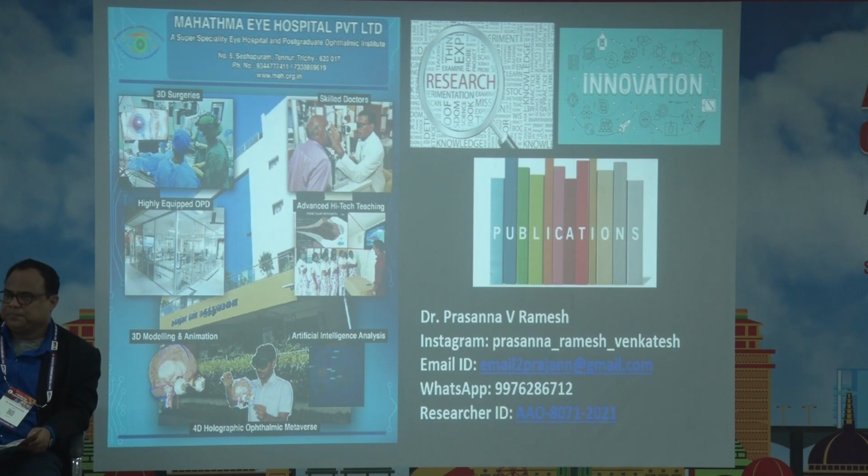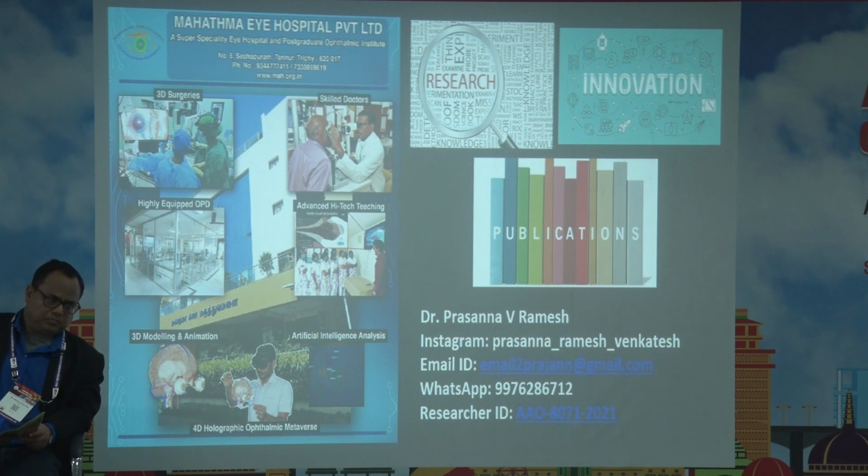Very, very nice thought, though. I mean, of course, I have never deployed it in my practice. There seems to be a lot of discussion in glaucoma circles as to how much you would base your decision only, mainly on OCT, right? I mean, if you have changes in the OCT, would you go ahead and treat, or would you go ahead and act? Yes, sir. It seems like, because you had the variation, did not really say.